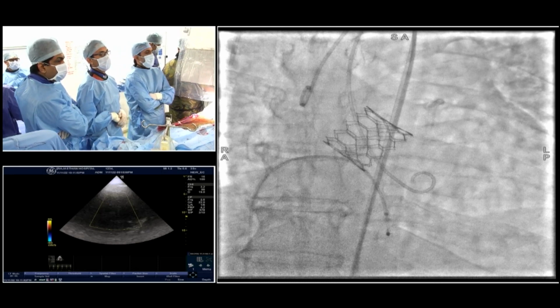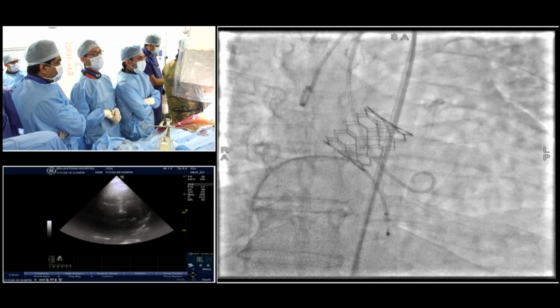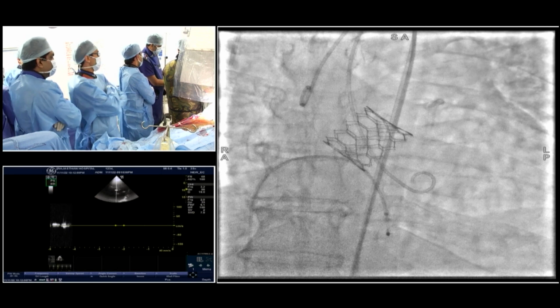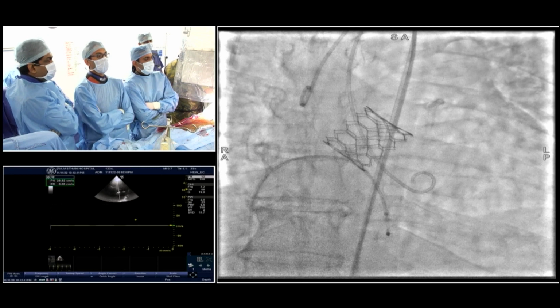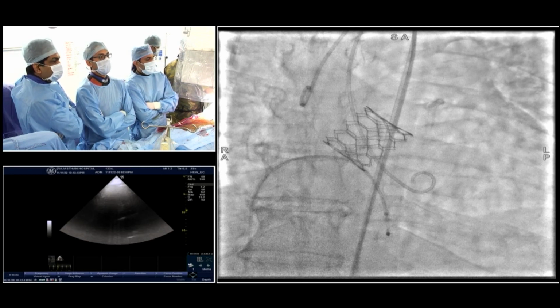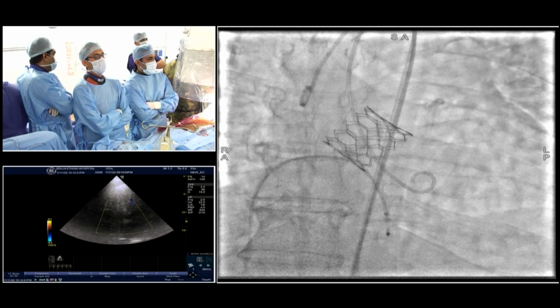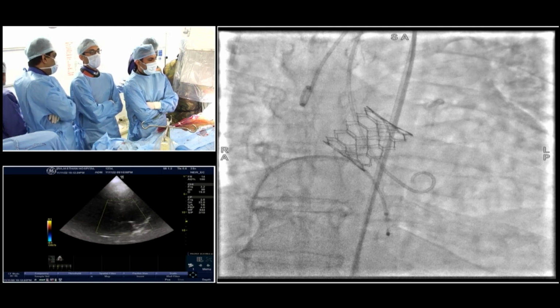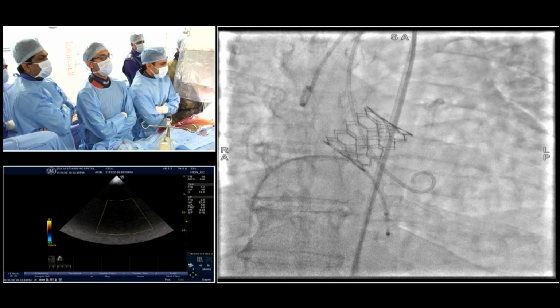But the point is, with bicuspid severe calcification, to get an added imaging modality about coronary obstruction risk and valve size, I think it's very, very useful. Point well taken. But I just logically feel that when you pre-dilate, you dilate with the balloon, and when you do not pre-dilate, in any case you dilate the valve stent. The balloon expansion creating trauma is more or less identical whether it's done pre or post, because ultimately you have to dilate.